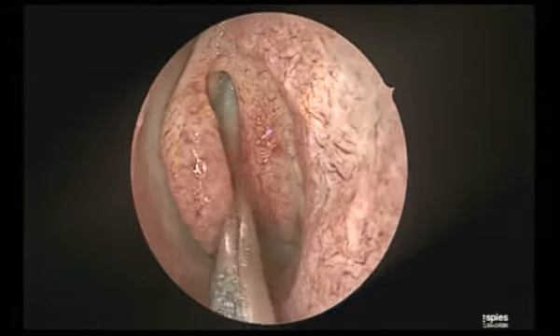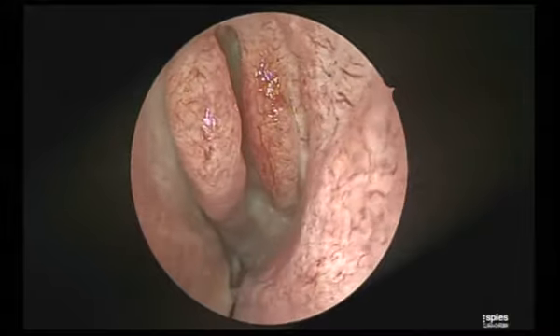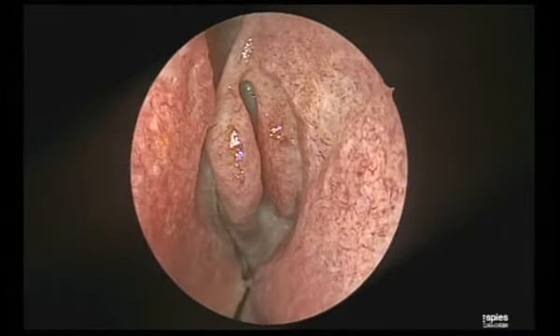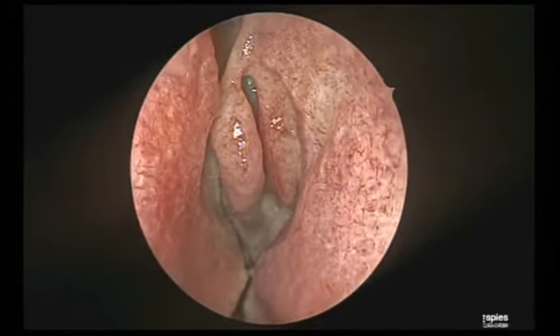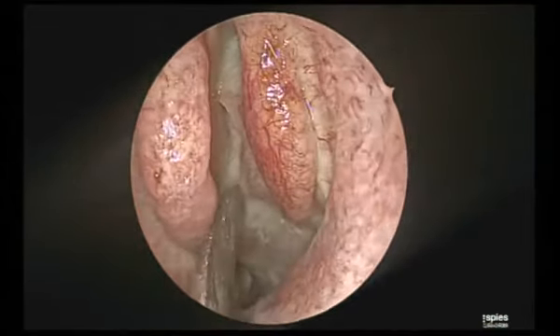So a lot of things are discussed about the blood pressure. Believe me, nowadays, stop looking at the blood pressure. Even I operate under normotensive conditions. The only thing I am concerned about regarding bleeding is the heart rate.